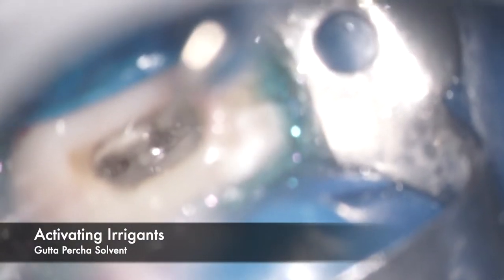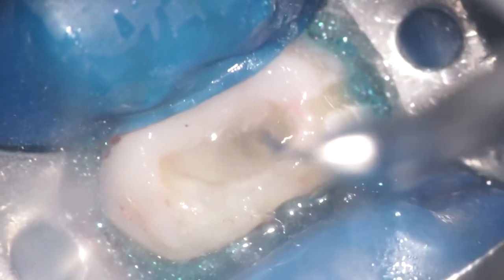After seeing the instrument slightly loose, I also noticed some remnants of old gutta-percha points. So instead of EDTA, we switch to a gutta-percha solvent and activate it with ultrasonics to remove the old GP remnants. You can see a small bit is out, and then we activate further with fresh gutta-percha solvent.